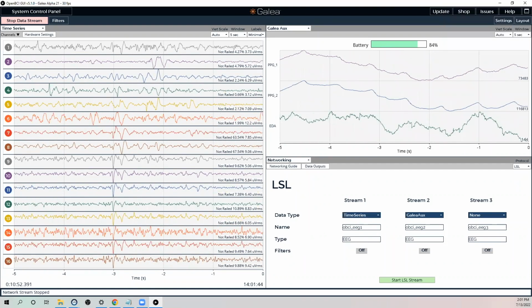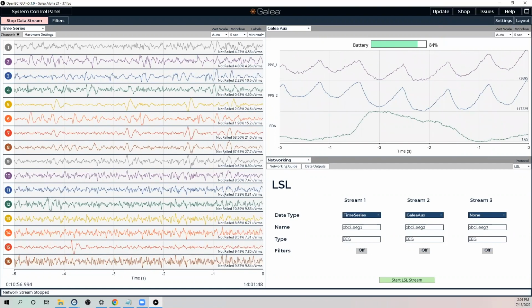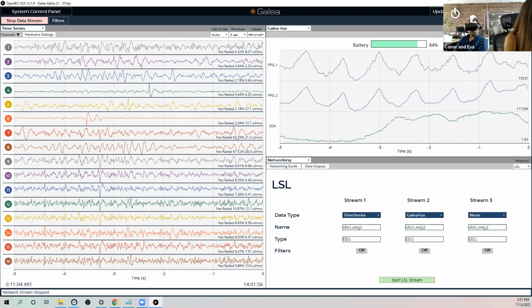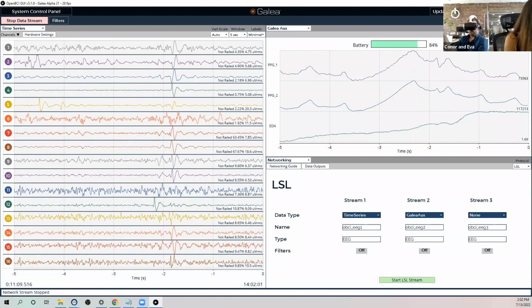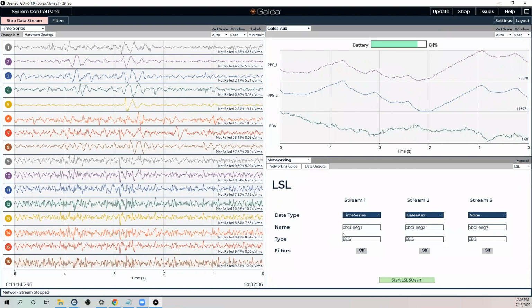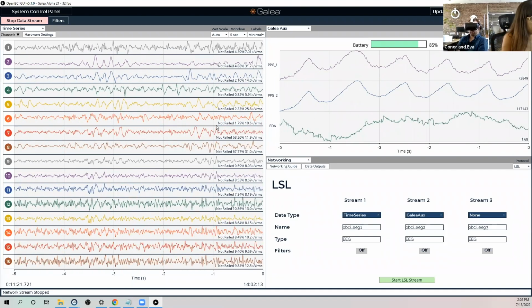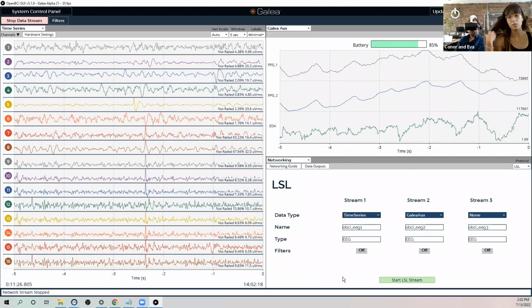What about with the SDK, or skipping the GUI and trying to build from scratch? We could talk more to that. Right now the GUI is in some ways kind of an unnecessary middleman between higher level applications and the device data. The GUI uses BrainFlow under the hood to extract the data from the radio. If you wanted to bring the raw data straight into a different application, you could use BrainFlow to do that and bypass the GUI altogether.